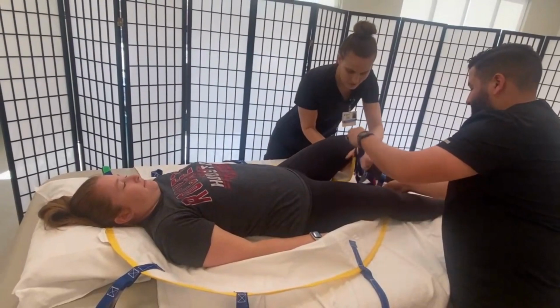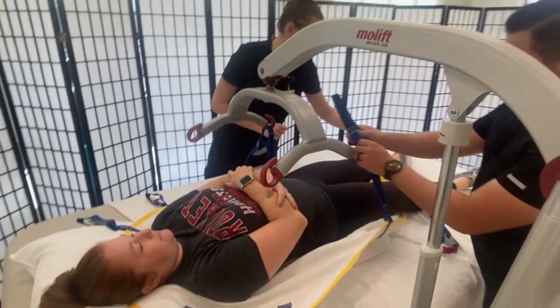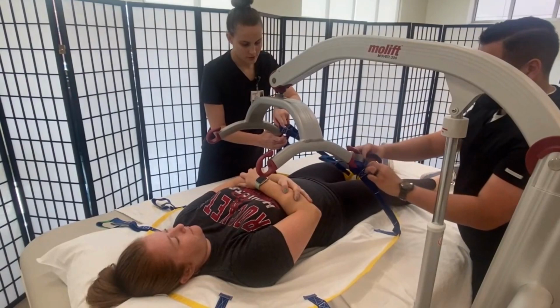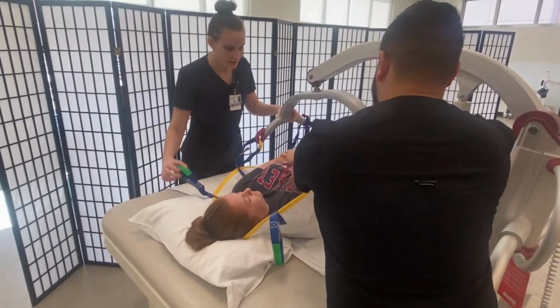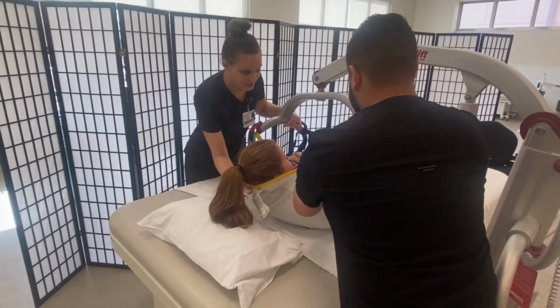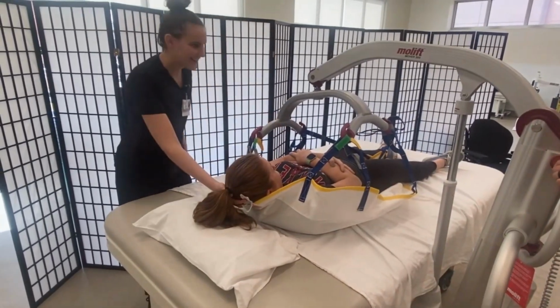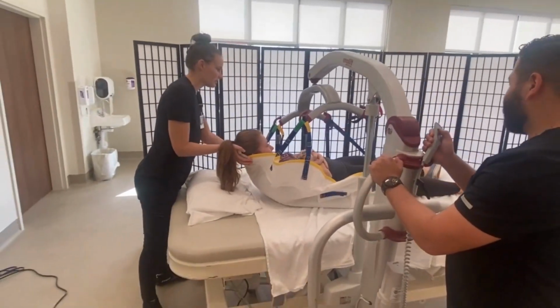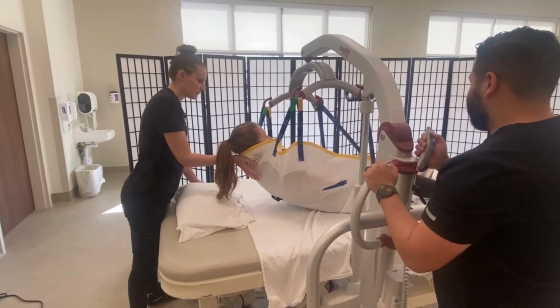Once the sling is in place, the lift is positioned with the arms of the lift over the patient's center. The straps on the sling are then attached to the lift arms, and after testing for security, the lift is able to be raised or lowered to move the patient between the two locations. Portable lifts have locks on the wheels for safety and a steering mechanism to allow for a safer transfer.